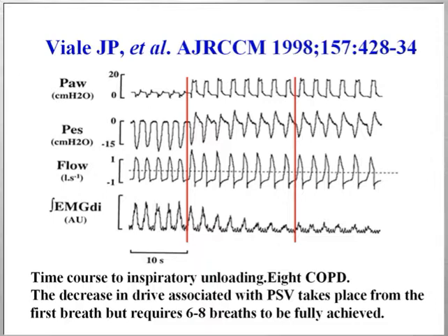And perhaps this particular behavior, this inability of the respiratory center controllers to adapt instantaneously to this inspiratory assistance, might explain why, for instance, synchronized intermittent mandatory ventilation didn't work when it was used to wean patients from mechanical ventilation, because it's unable to provide permanent unloading of the respiratory muscles because of permanent changes in the levels of assistance.